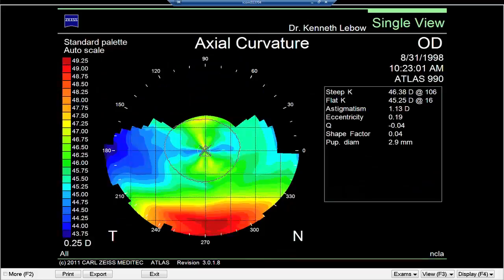Looking at the right eye topography: the first thing to pay attention to is that the shape factor is about 0.04 — we're dealing with a very, very low prolate shape, not typical of normal corneal anatomy. Looking at the pattern on the topography map, we see what looks like the presence of a very faint with-the-rule band centrally, but significant flattening temporally and significant steepening inferiorly. This is simply not the type of topography we would associate with a normal cornea.